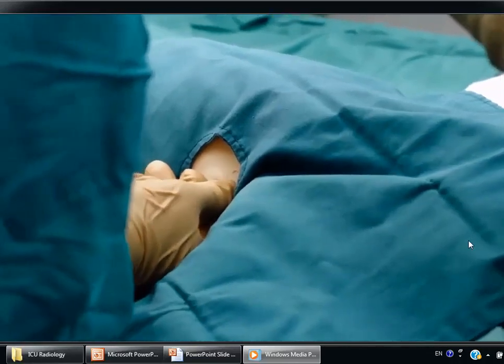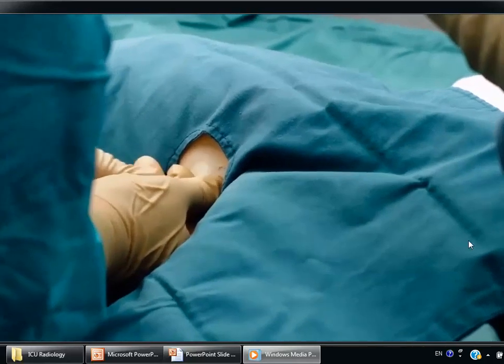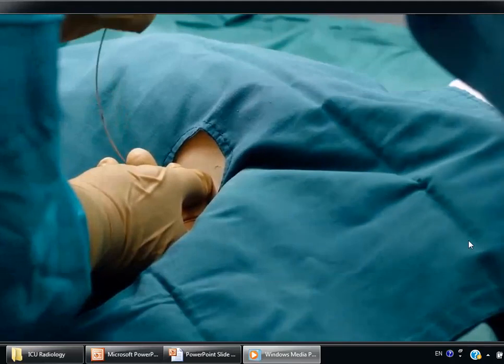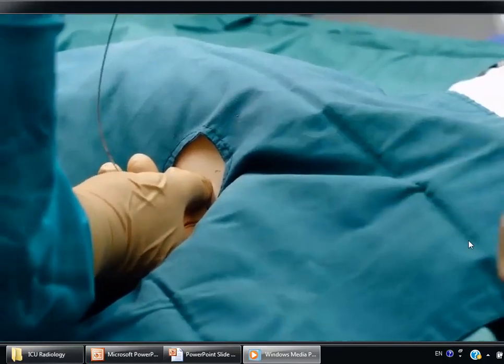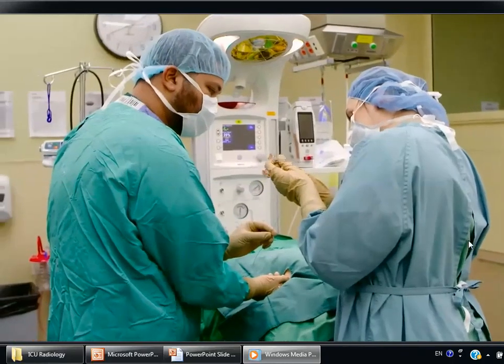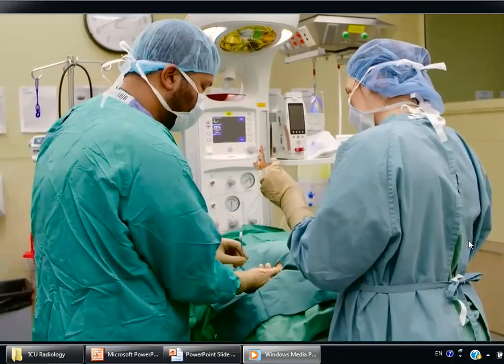We are dilating. Then we remove it. Bigger size. Pass the larger dilator along the wire, through the skin about 1 centimeter, angling anteriorly, and then remove.